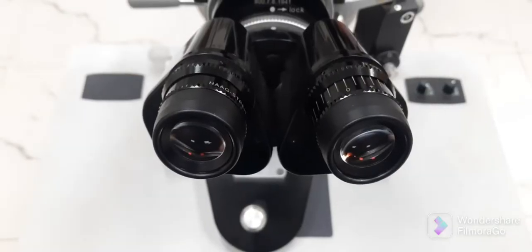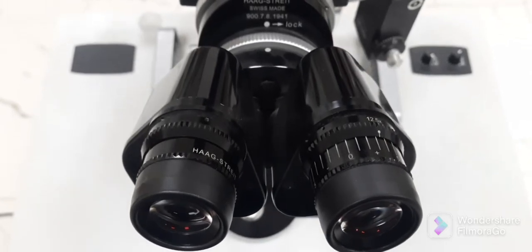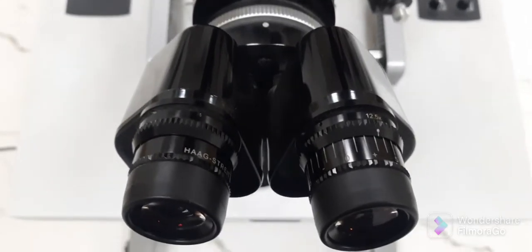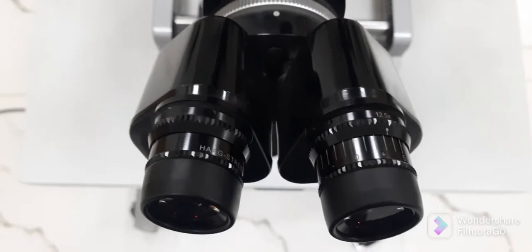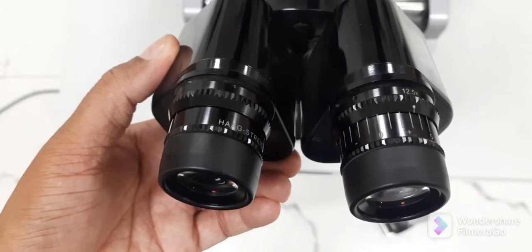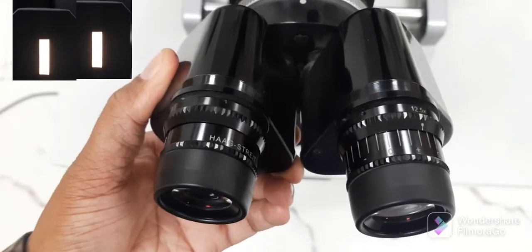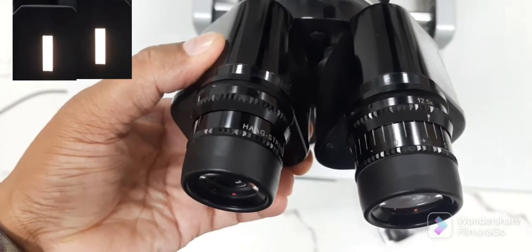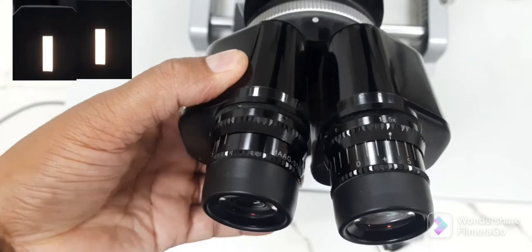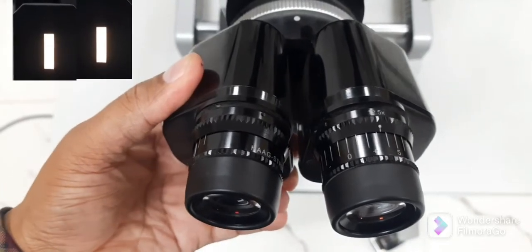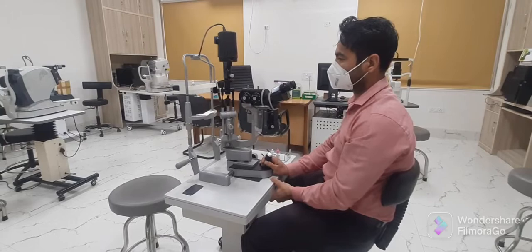Now the next most important step is to adjust the IPD for binocular single vision and better stereopsis during the examination. When the IPD is not adjusted according to the examiner, the examiner perceives two different targets through the eyepiece. After adjusting the IPD, the target appears to be single through both eyepieces.